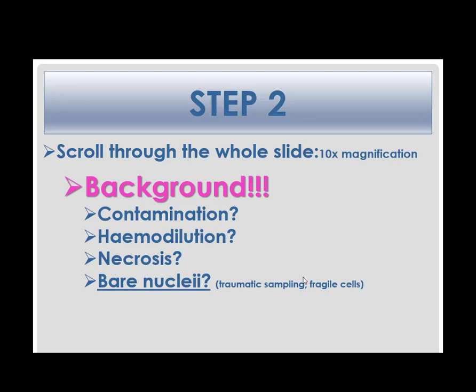However, if they are present on a carefully prepared slide within rafts of cytoplasm, it may be the nature of the cells themselves that they are particularly fragile. Tumour cells are more fragile than normal cells. This is especially true in lymphoma and neuroendocrine tumours. It is even how we identify some neuroendocrine tumours, by finding naked nuclei surrounded by a raft of cytoplasm. What are the neuroendocrine tumours? Well, for example, insulinoma, thyroid tumours, and pheochromocytoma.